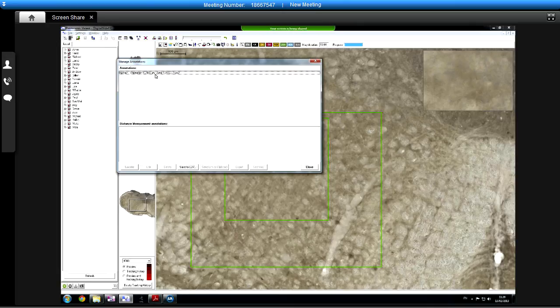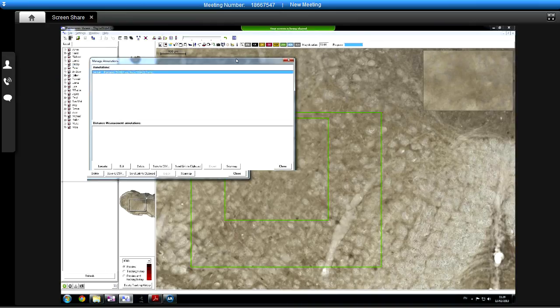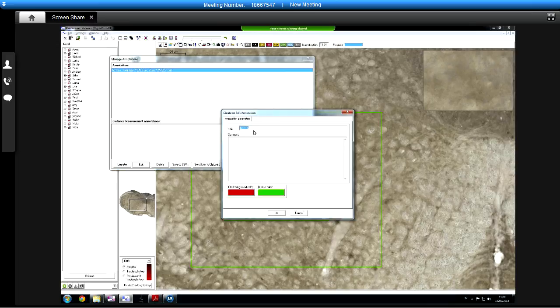And if you want to go back and label it afterwards, because you didn't label it to begin with, in here you can also click Edit, and you can again have access to that to change that. As I say, it makes no difference if we just leave it as caption, caption, caption, but when you get some data out later, it makes a lot more sense if they've got a sensible name.